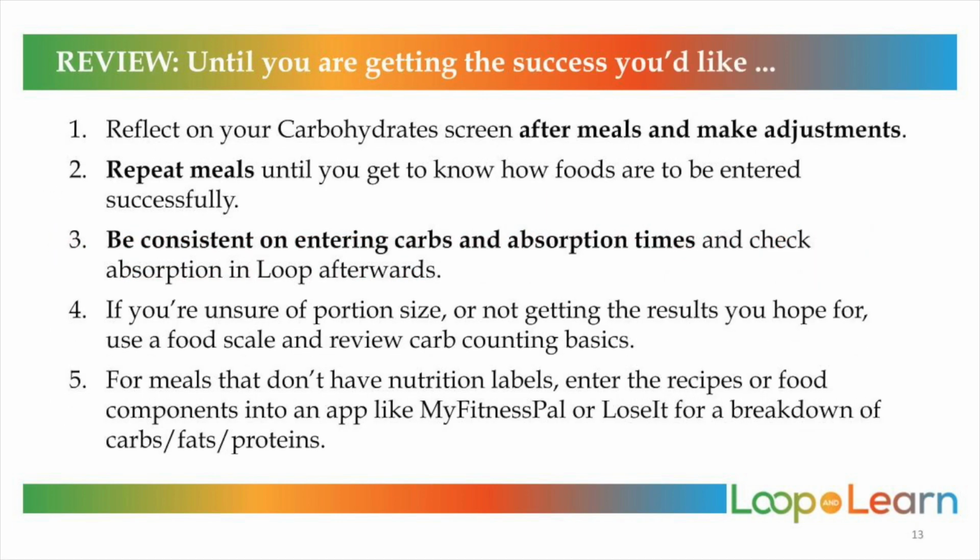Finally, let's review the basics. Always take a look at your carbohydrate screen after meals and think what adjustments need to be made next time. Ask yourself what worked, what didn't. Repeat meals until you know how to enter the meal successfully. Try and limit your variables and be consistent with your carb entry and adjust the absorption time based on what you're eating. Check your portion size, perhaps with a food scale, and review your carb counting. Take a look at the handy apps available in the App Store. If things are not improving, go back and test your looping foundation, then try again.